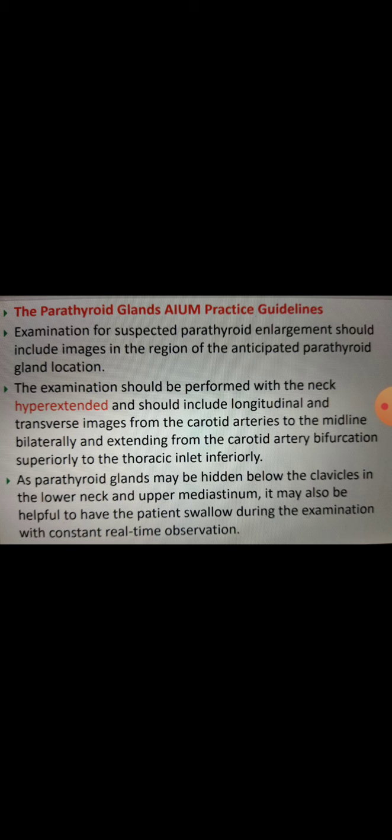The patient should be in the supine position. Once again, we will be using the high frequency probe, and you can very well visualize these glands using it. The examination should be performed with the neck in the hyperextended position, and you will definitely take longitudinal and transverse images.